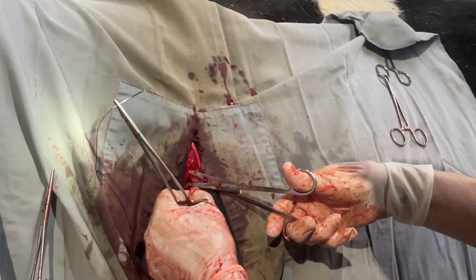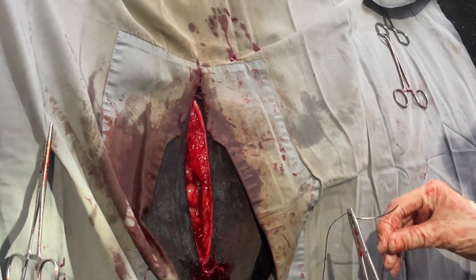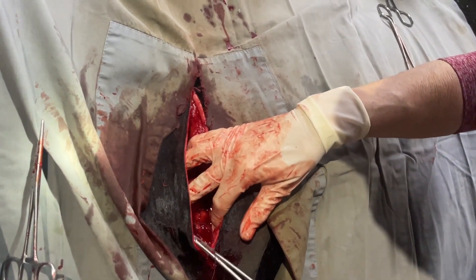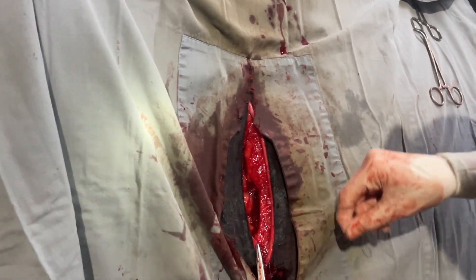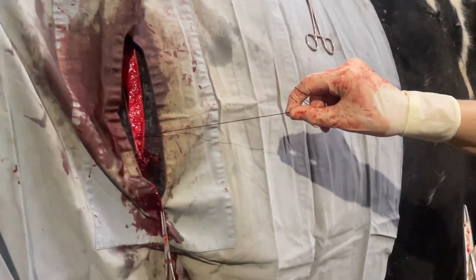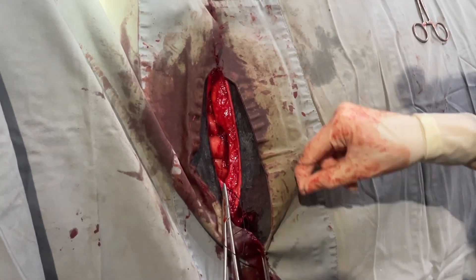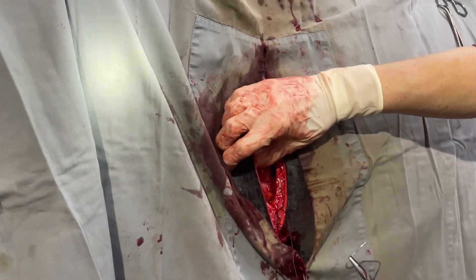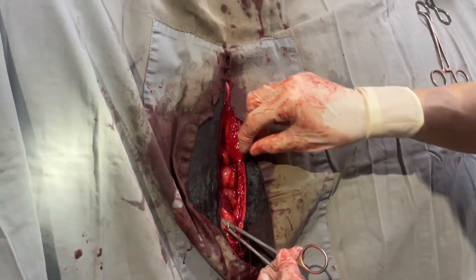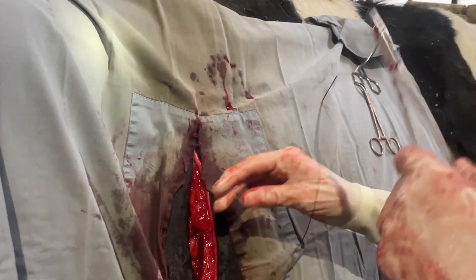This thread that you use on the inside of the cow — it must just biodegrade in there, right? It does, it dissolves, very slowly. So basically the incision is just for you to be able to get your arm in there, drain the gas, and pull the abomasum back over where it's supposed to be. Well, while we're in there, we're also feeling around for anything abnormal, like a stomach ulcer — may as well do a checkup if you've got her open. Hardware, big livers, things you can't feel or see otherwise.